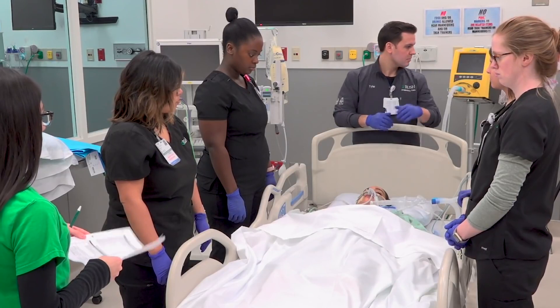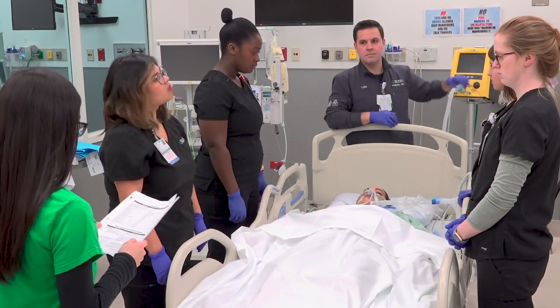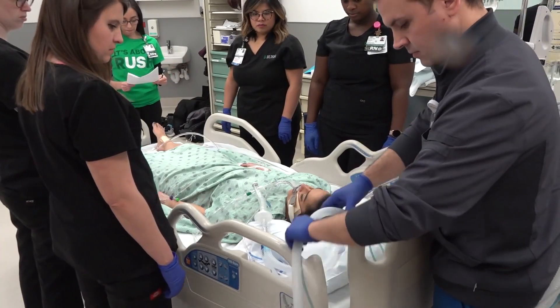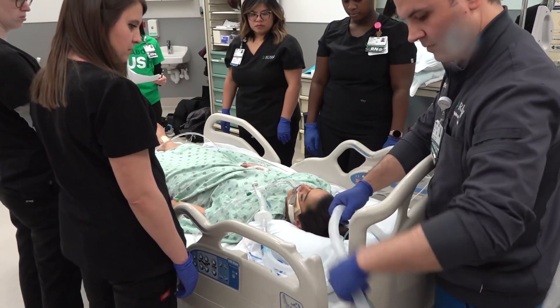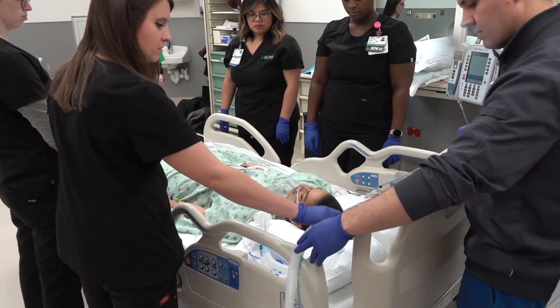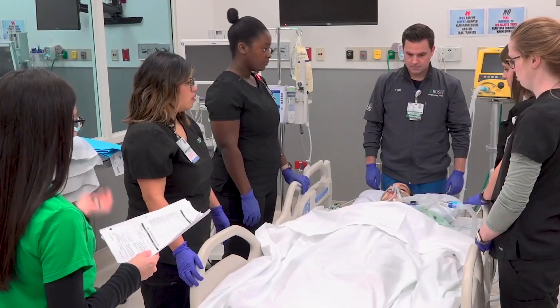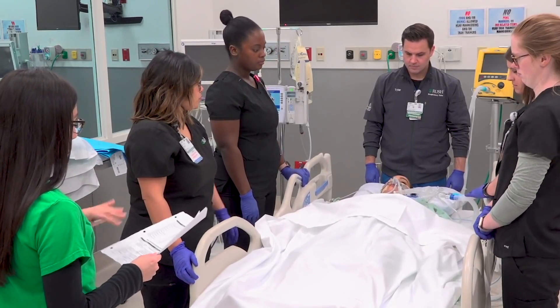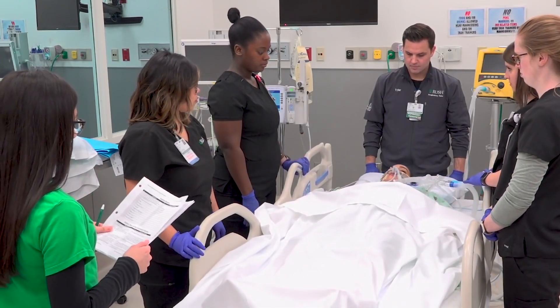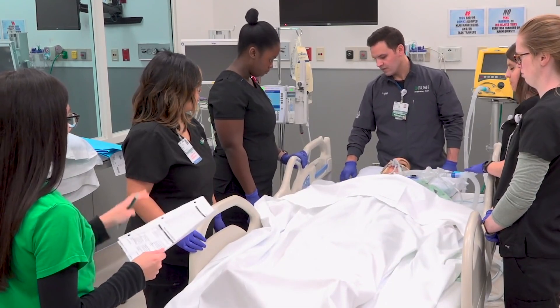The respiratory therapist will pre-oxygenate the patient with 100% oxygen. They will ensure enough slack is present with the ventilator circuit, and the headboard of the bed will be removed. The staff members will raise the bed to the desired height, maximally inflate the bed, place it in flat position, and side rails will be removed.